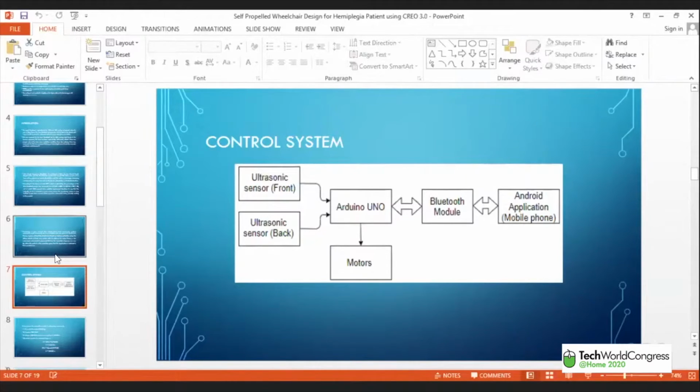And this had to be battery operated, because we cannot afford to have wires dangling around, right? If you remember the car batteries that are there in your car, in your gearless machines like the Activa and all, right? The same kind of batteries can be utilized here also. It can be easily placed below the seat of the wheelchair. If you have noticed a wheelchair, below the seat there is a little space available, it can be fitted over there, right? So that it can supply power to the desired devices, the motors along with the drivers, of course.